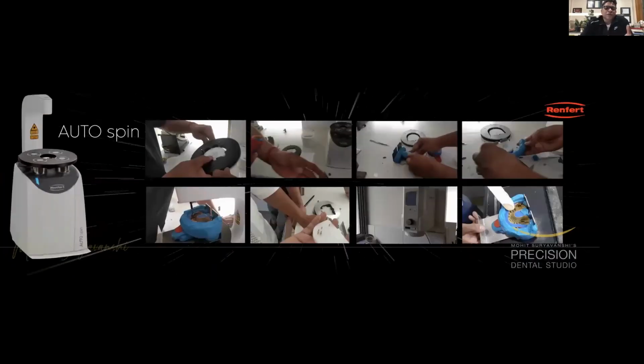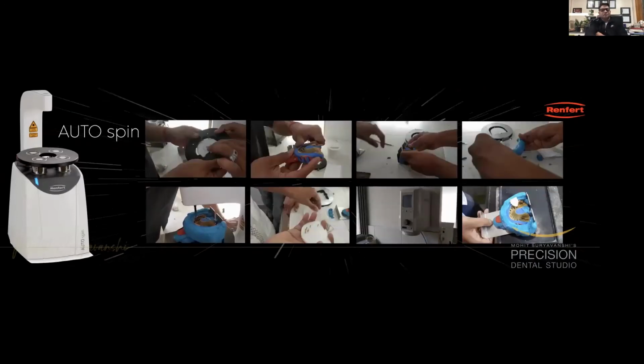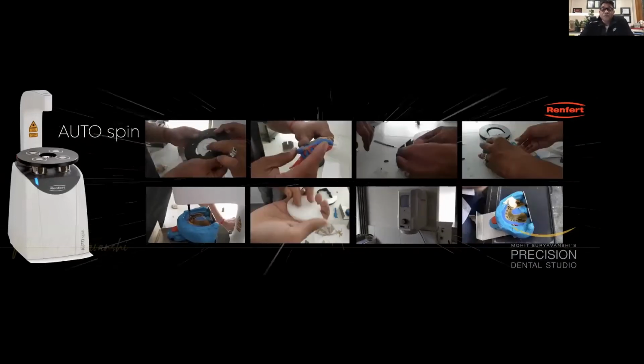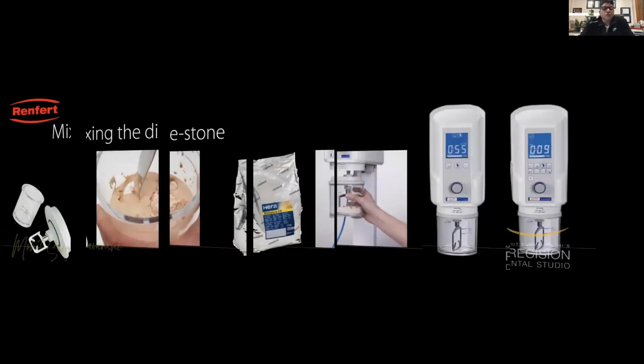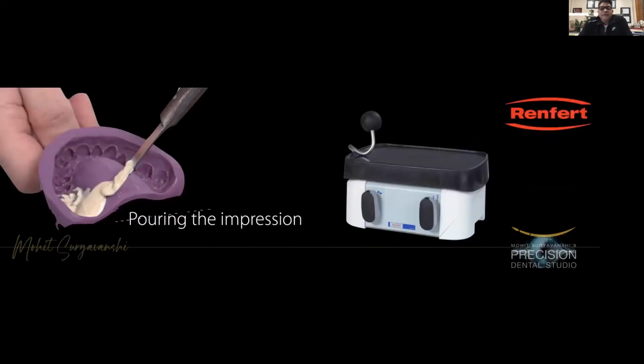We usually have all our models done on this auto spin, which is a very convenient model system. It makes your model look so beautiful. At the same time, it has a lot of ease of use. We follow all the protocols of mixing the right powder and liquid ratio, which makes the model just perfect the way the dentist has taken the impression. There is no dimensional instability. If you follow all these protocols, then what you get is a perfect replica of what the impression has been taken.